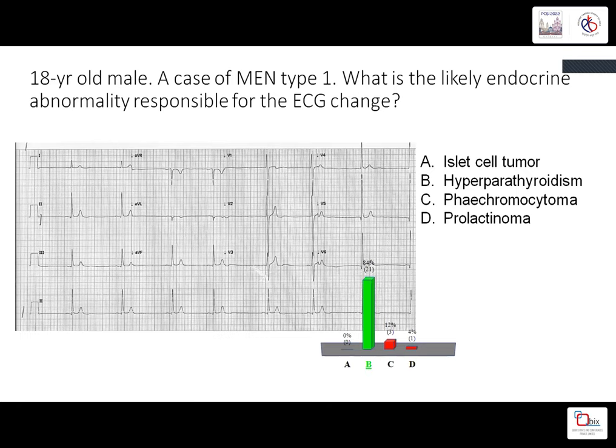Yes, sir. Very good. It's very obvious. Everyone is primarily looking at the ECG abnormalities. The rate is low, sinus, around 60, say 55. And also the QT is shorter. A small J wave, you can say, is also there. So short QT with the J wave.